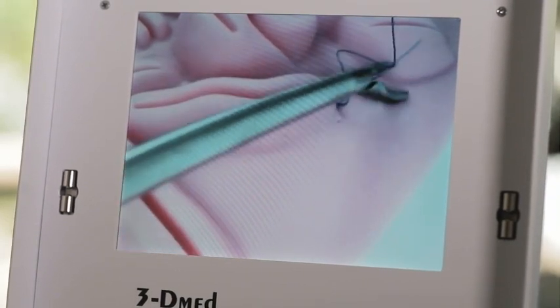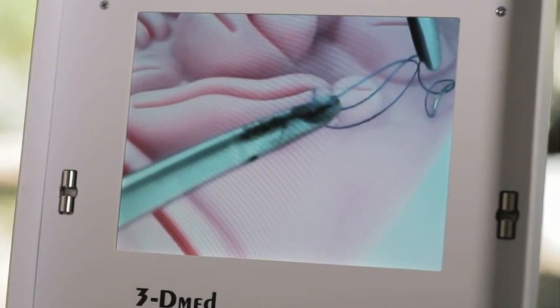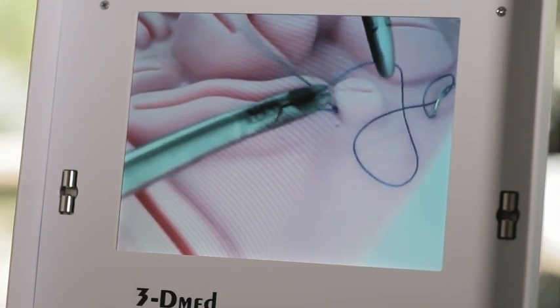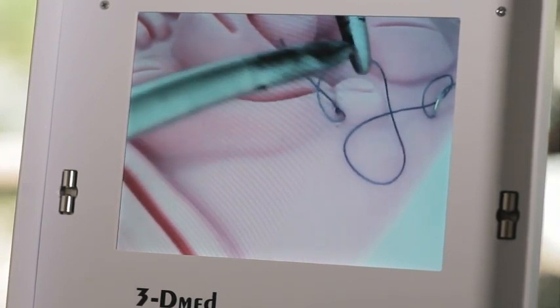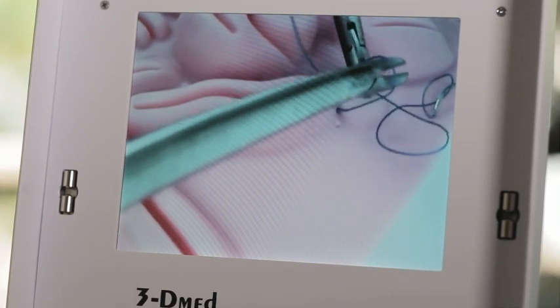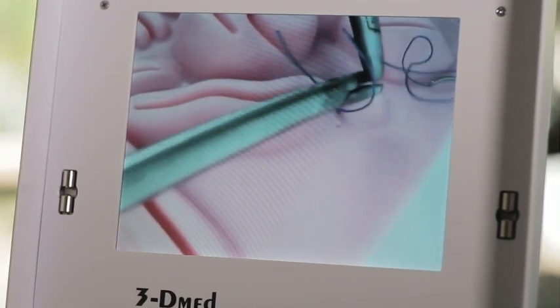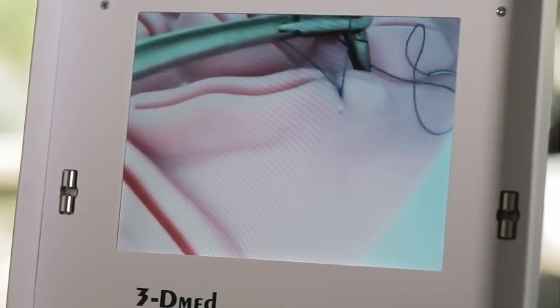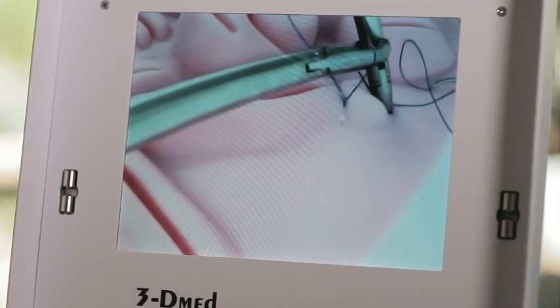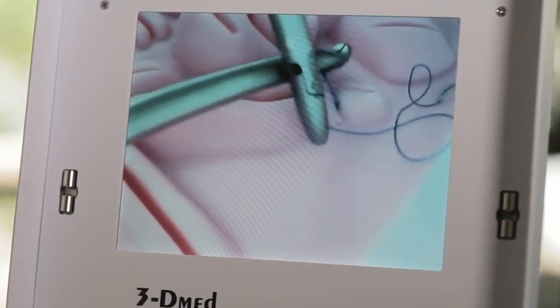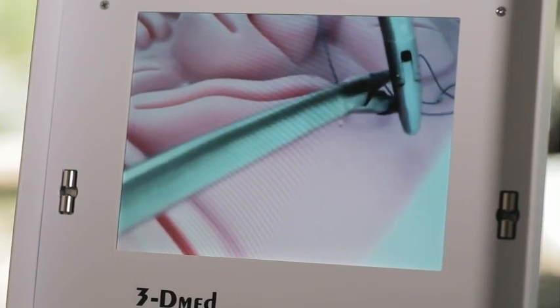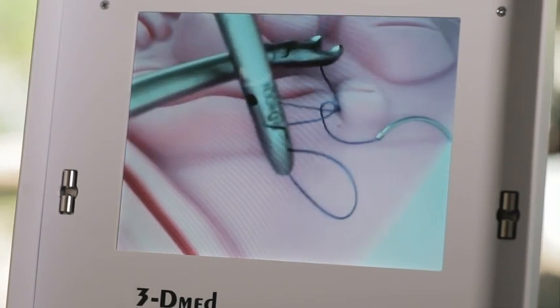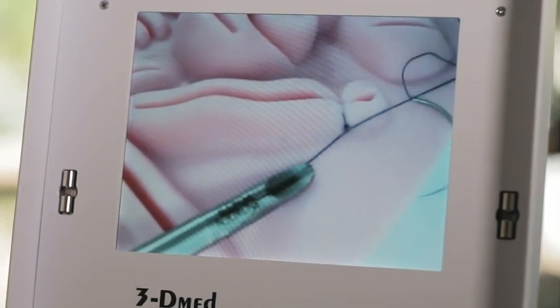With the suture pointing directly at me I will wrap in the other direction. I didn't leave myself enough room here. You might want to open the needle driver to give yourself a little traction as you begin your wrap. I will load it further back and give myself some slack as I go looking for the end. Found it and here's the rest of my knot.